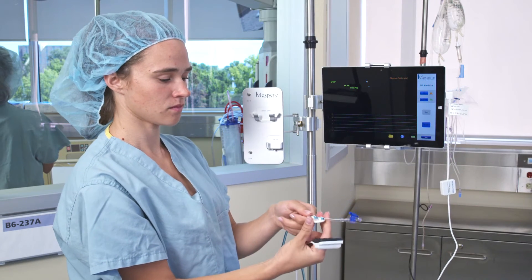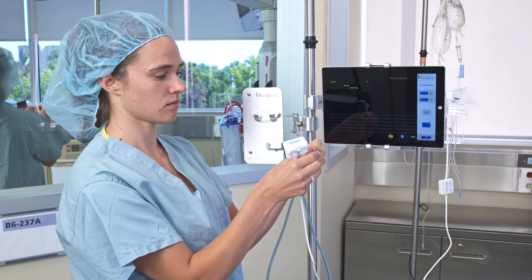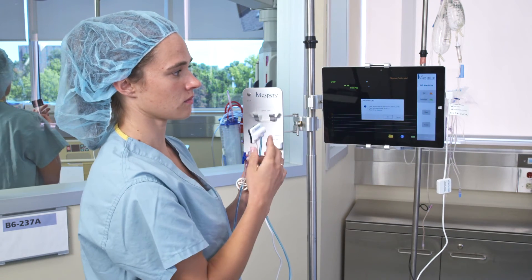Position the reference holder so that the top of the blue liquid in the tubing is located in the middle of the reference holder. Ensure that the stopcock is in the open position. Press the calibration button and follow instructions.